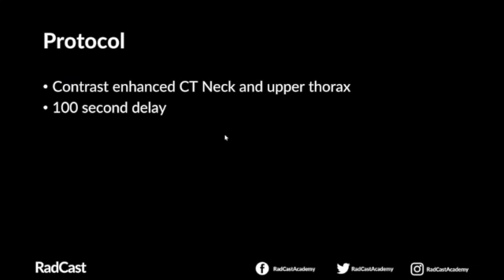So when you're protocoling an acute neck scan, do a contrast enhanced CT neck with the upper thorax included, because you want to see if infection is spreading into the thorax, and about a 100-second delay is typically what we recommend.